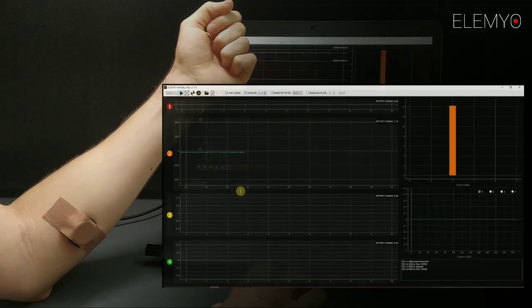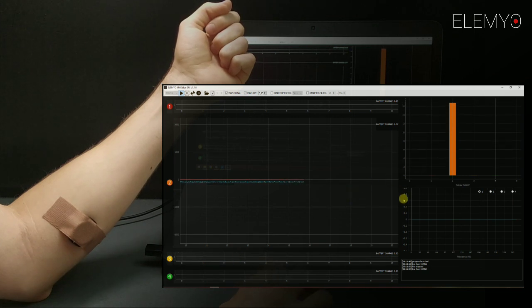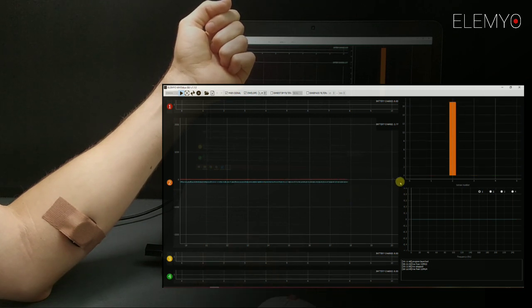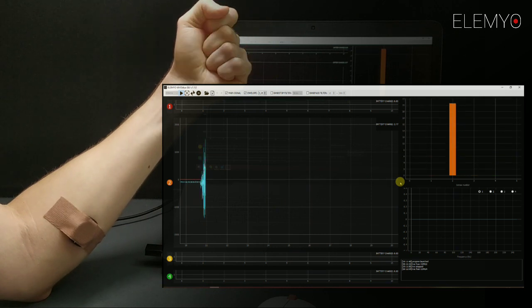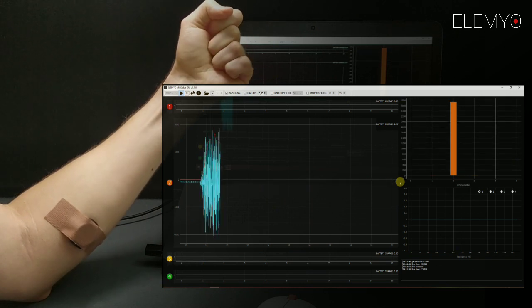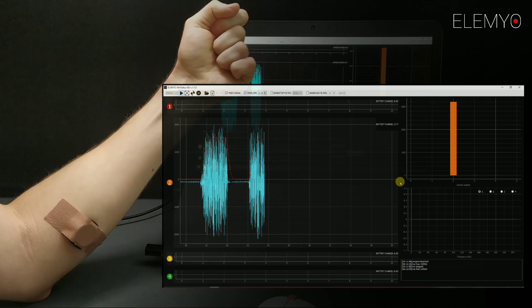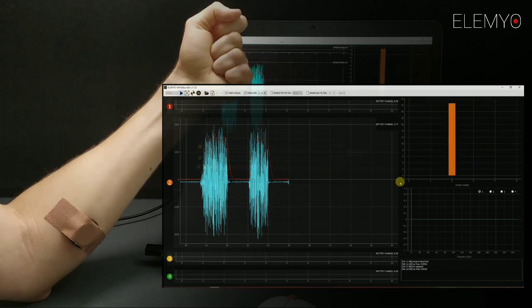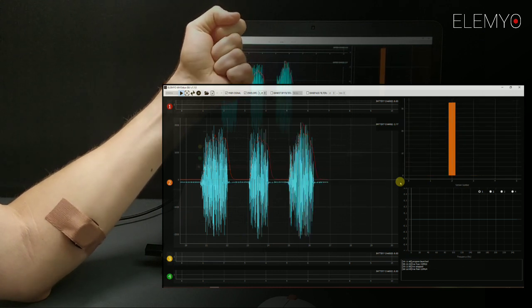We use just one sensor here, so we are making the signal window higher. Simply drag the window borders to do it. Here we are performing four almost equal muscle contractions. And we can see them on the screen in real time.